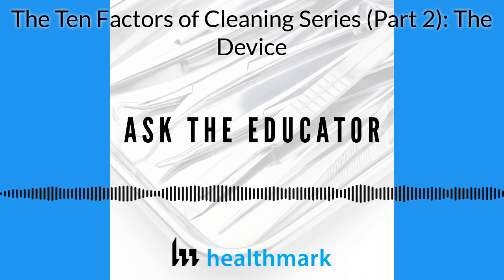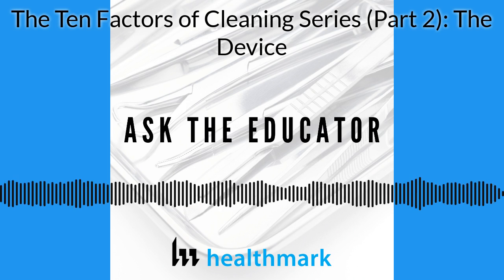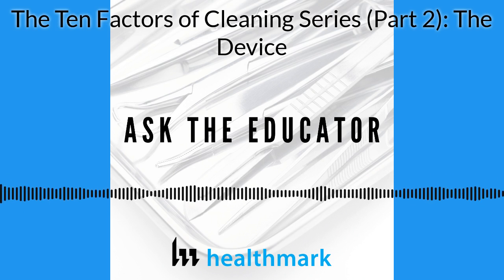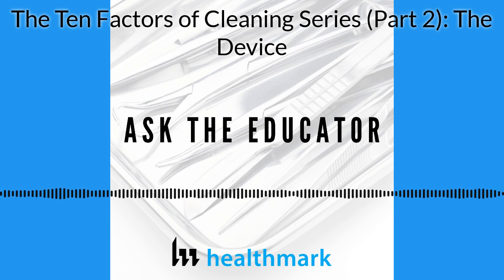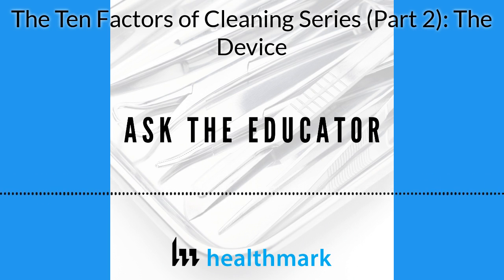And I try to break it up into two groups, Kevin. Either it's simple or complex. And people would say, well, Steve, that maybe is too basic. But there is an ISO document out there that I think breaks it down into 15 or 16 different categories. But if you think of it, simple devices are without really any physical or challenging design features like osteotome, bone spikes, probes. And then everything else gets complex. So I don't know, am I breaking it down too simple there, Kevin?